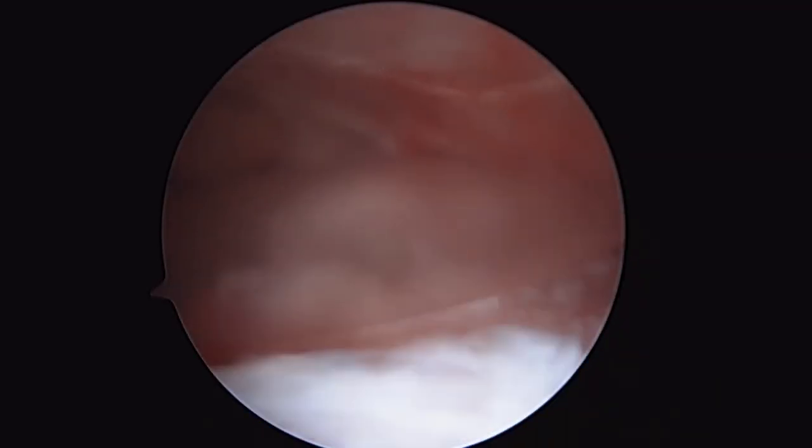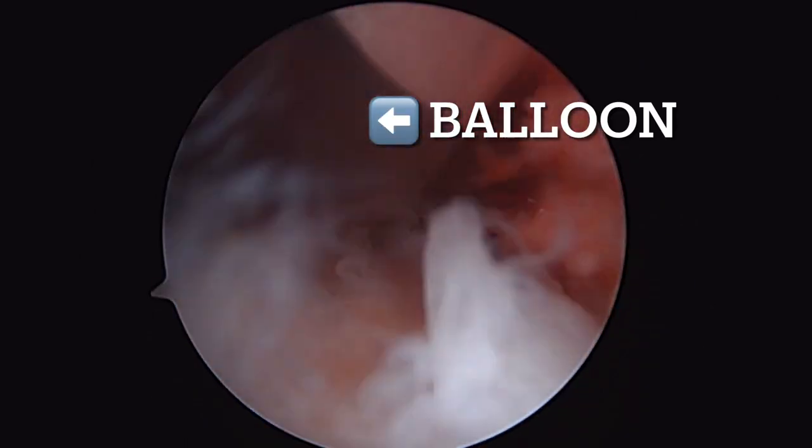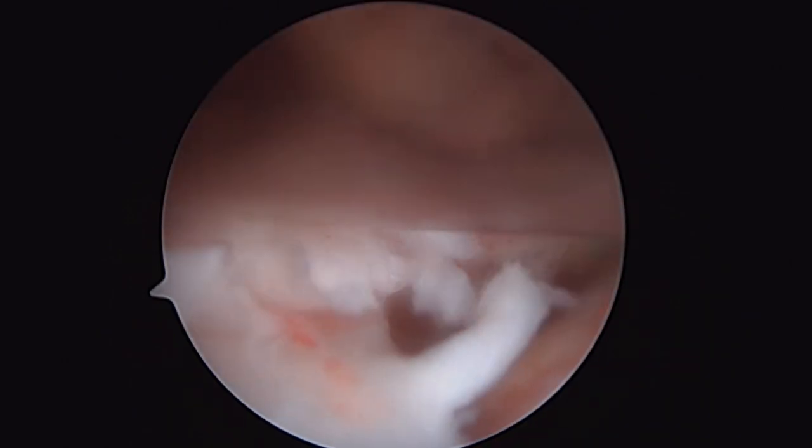This surgery is one of the simplest and quickest surgeries I do. It literally takes about 15 minutes to perform the balloon spacer procedure. We simply measure the size of the tendon tear, place the device, and inject saline into it, making sure it unfurls properly. We can immediately see the cushion effect as we passively rotate the shoulder. In this surgical video, you can see the humeral head rotating down below, and the balloon can be seen just above it. The space is evident since the balloon is clear. We often perform a bicep tenodesis at the same time, which can add some time to the procedure and several weeks of weightlifting restrictions while the bicep heals.